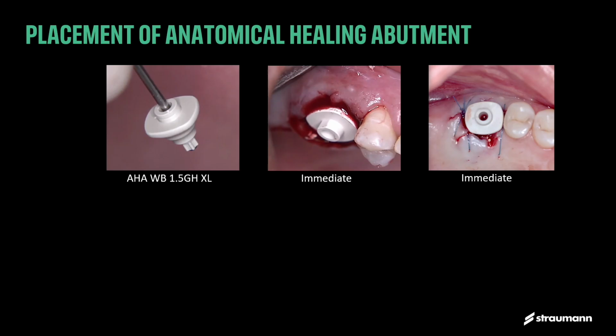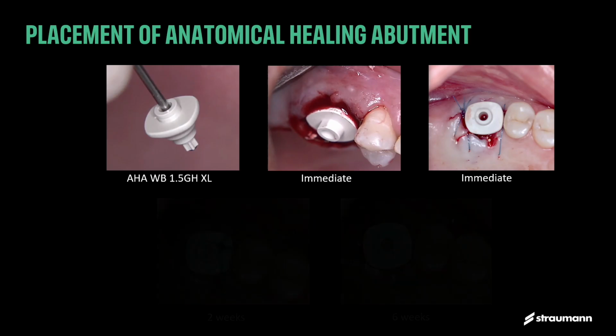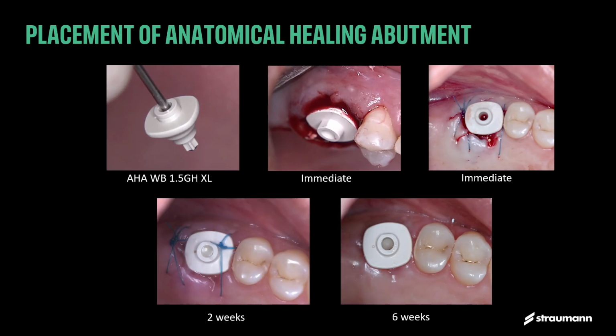After I just placed onto that site. What we did, because during the extraction was quite some bruising and some tissue damages there, so I did some small sutures, small single sutures, just to keep the tissue in place. And then 2 weeks healing. Again, the sutures very loose, the tissue behaving and coexisting with the component very nicely.